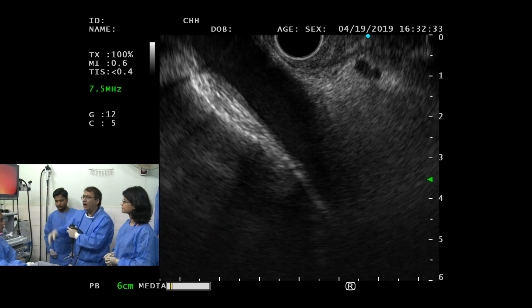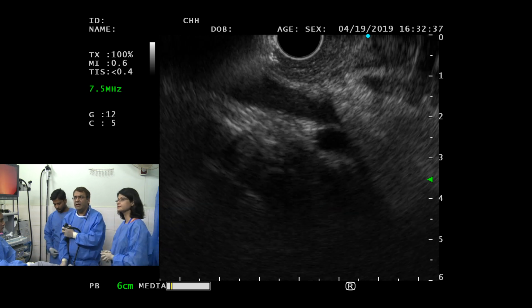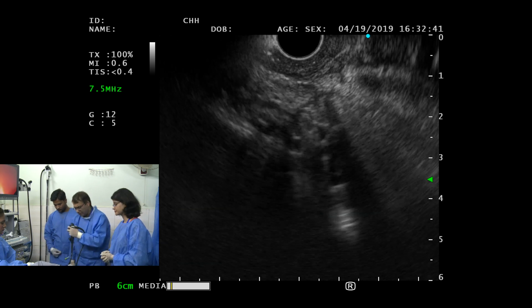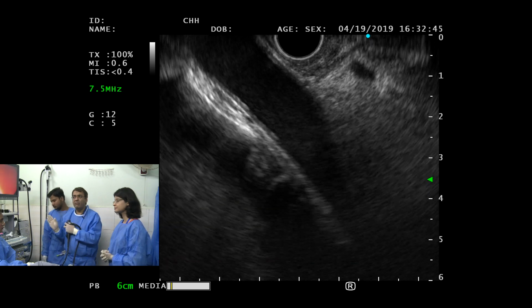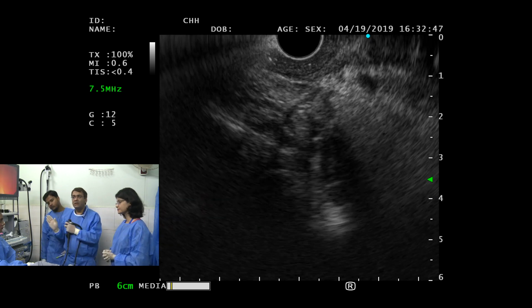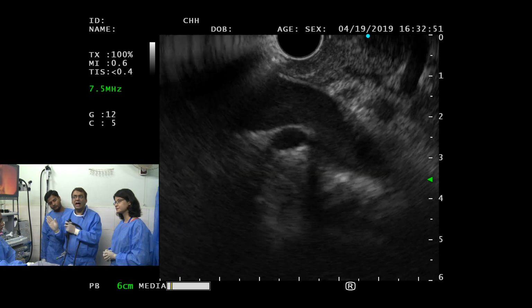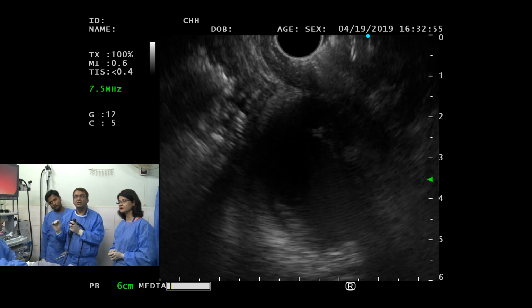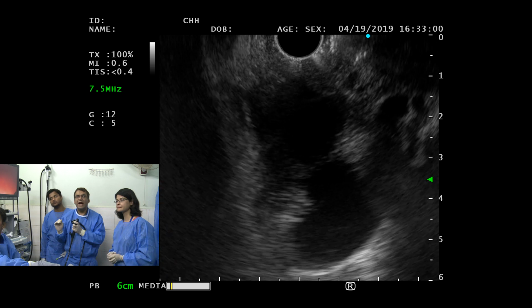My goal is to find the aorta. So the only thing I did is rotate right or left, and I see the aorta right there. From here, look at my scope. Aorta right here. I'm not using my right hand, okay? A little bit to the left rotation, you see the IVC, yeah okay? Further left rotation, right kidney, it's gonna be kidney. I don't wanna fall back.